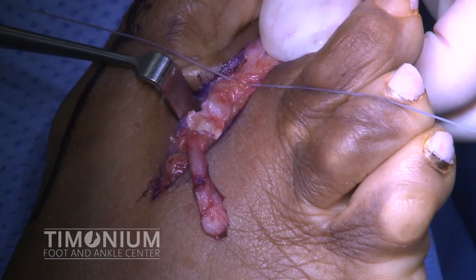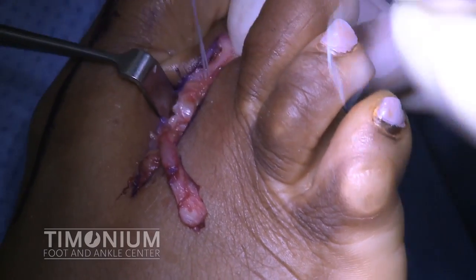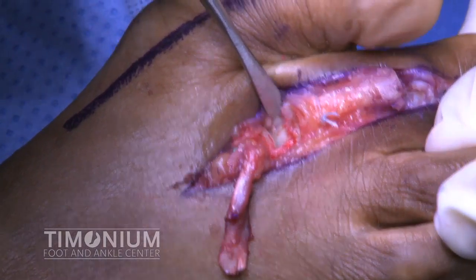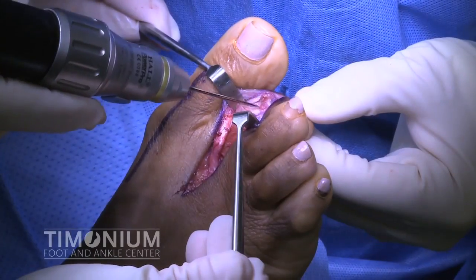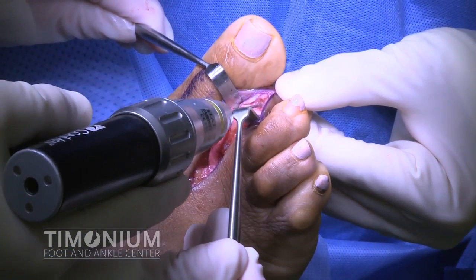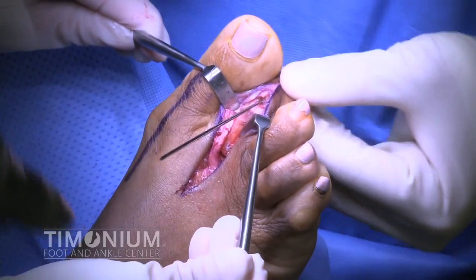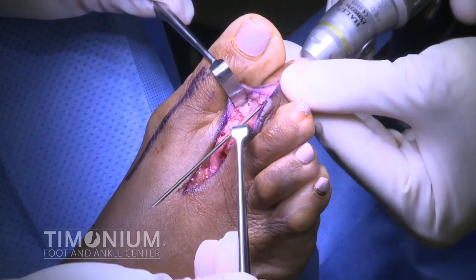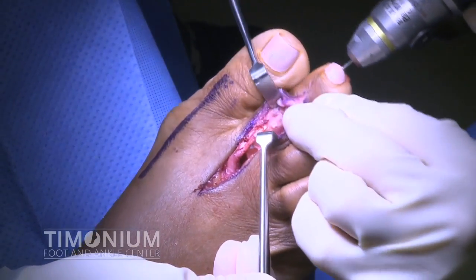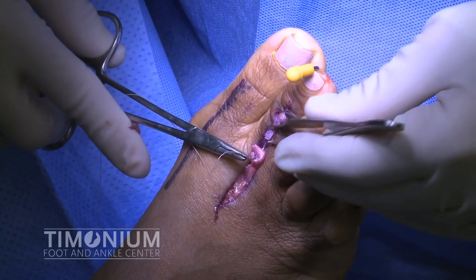With the toe held in slight plantar flexion at the second metatarsophalangeal joint, the fiber wire is tied down on top of the base of the proximal phalanx. We again demonstrate the advancement and tightening of the plantar plate. Next, a K-wire is drilled out the tip of the toe and then back across the proximal interphalangeal joint. The wire is used to hold the toe straight and is removed in the office 6 weeks after surgery. The extensor tendon is then re-apposed with absorbable sutures.